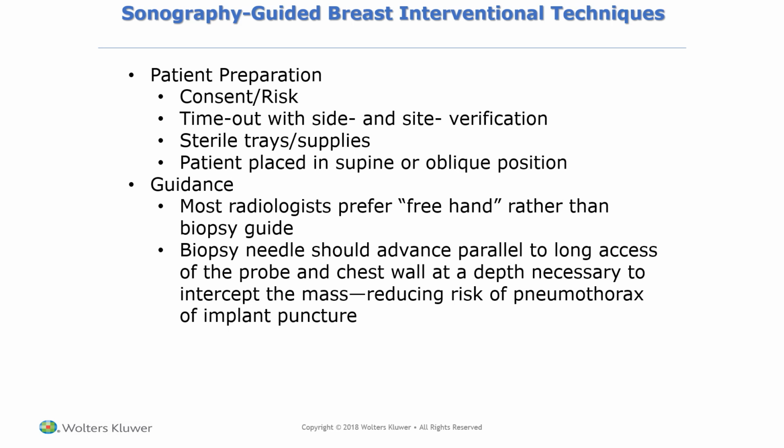So that would involve the processes of the procedure, details of how it's going to go, an explanation of the risks and the benefits, and then allow them to make that decision and sign the consent for you. Once the consent is signed, you're going to want to prepare the patient. So that would mean having them change their clothes, get in the appropriate position where the mass was best seen.